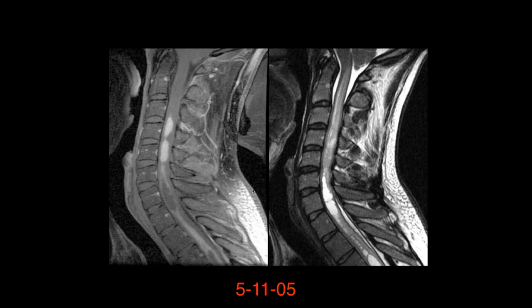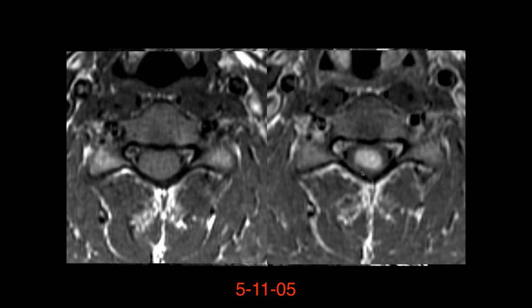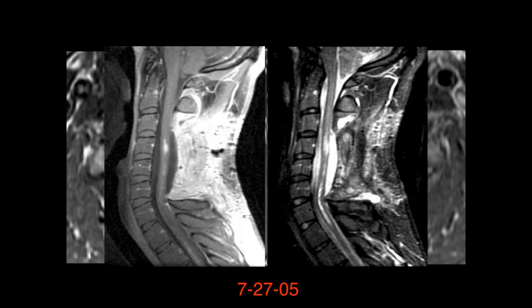Two sagittal fat-sat T2 images show extensive abnormal signal in the spinal cord with some cystic areas. On post-contrast there is enhancement — patchy enhancement within the spinal cord — and extensive involvement of the posterior elements.